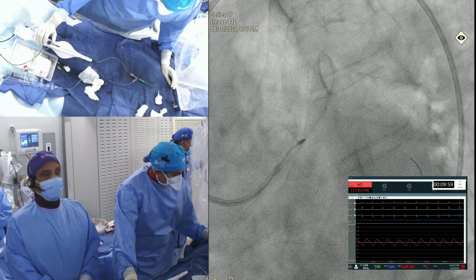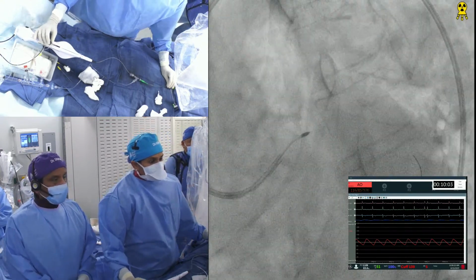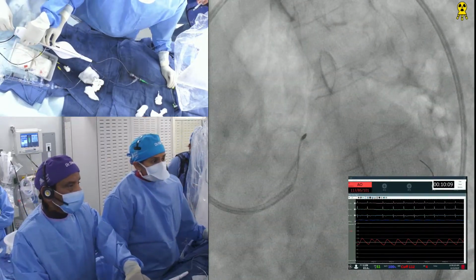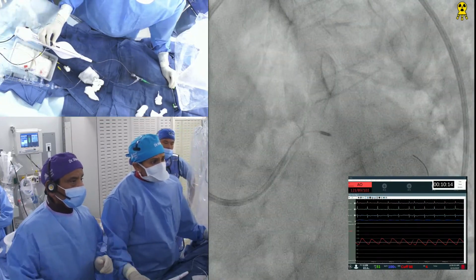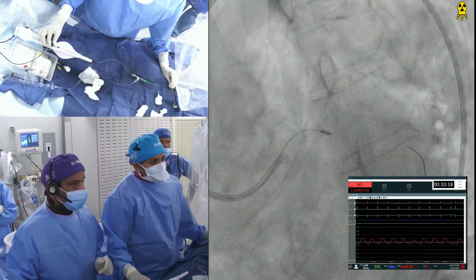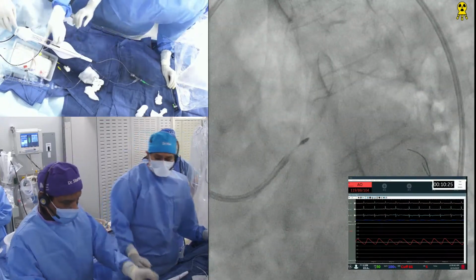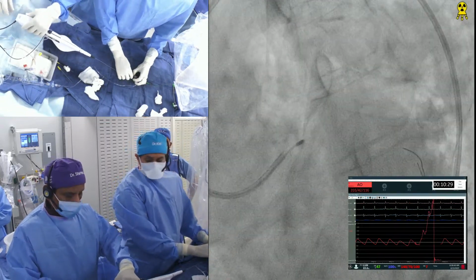Now, if the wire does not go further, I don't think I have enough wire. No, that's okay too. Remember, I say partial ablation. You do a half, a third. Sometimes that's good enough. Can we advance the wire? No, wire is stuck right now. Maybe I'll try again. No, that's what I'm saying. Don't. That's okay. Done? Good. Okay, let's go, you're coming out. So we probably did 70% of the lesion.